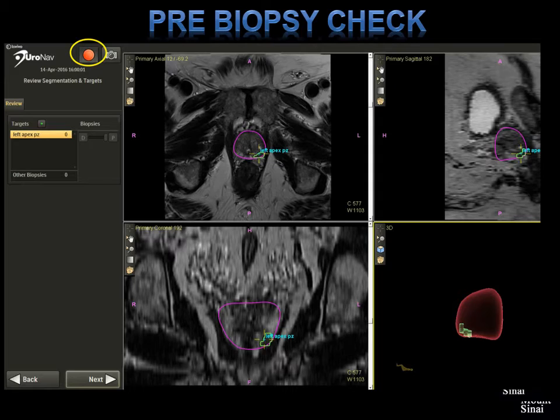Before you perform the biopsy, please turn on the recording. See the yellow circle in the upper left-hand corner of the screen? Press record. It's really important to be able to go back and look at your technique to determine if you hit the target or not, because sometimes there's a discordant path — this can be due to the MRI being over-read, the biopsy missing the target, or there being no cancer at all. It's easy to put these pieces together if you have video evidence.